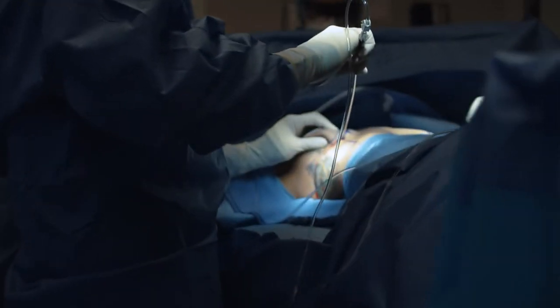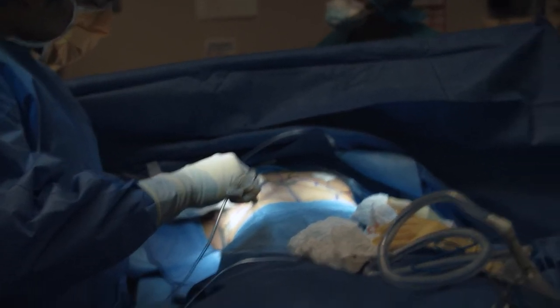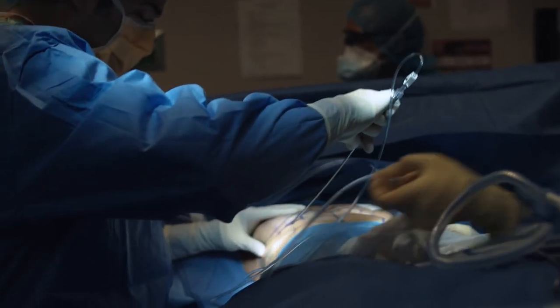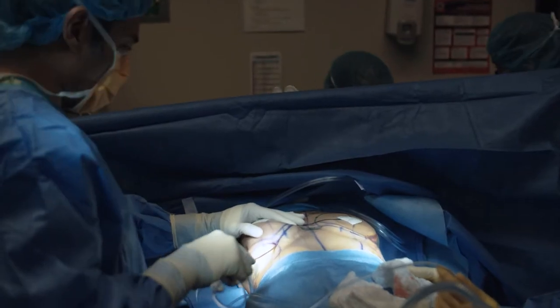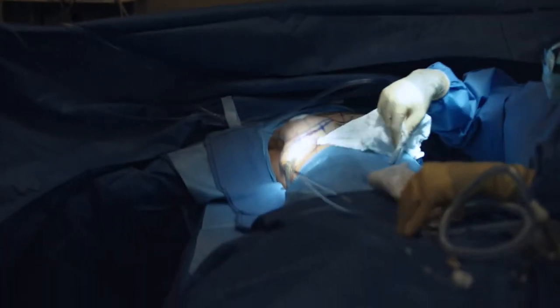First step is I'm putting in tumescent, my special solution that has antibiotics and anti-bleeding properties in it. It helps me do hydrodissection, to expand the pocket. So now I'll go to the other side while I'm working on this side.